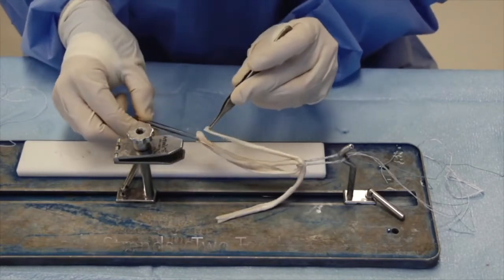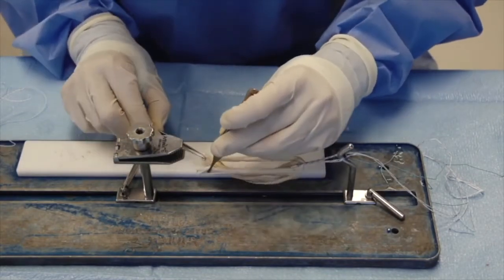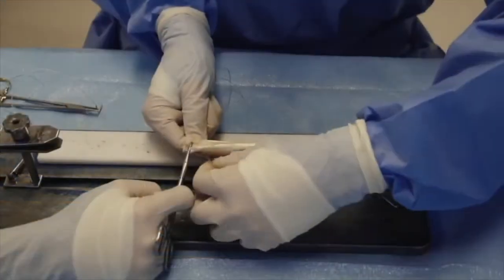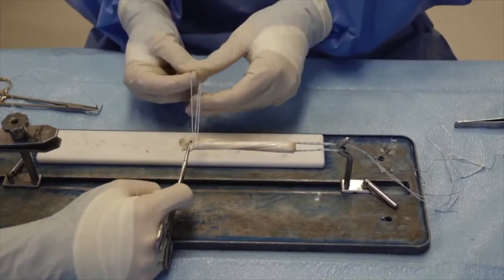We will demonstrate the four strand technique with two tendons. Both tendons are loaded in a suspensory device with a reverse orientation. A non-absorbable suture is passed twice around the four free ends of the graft.